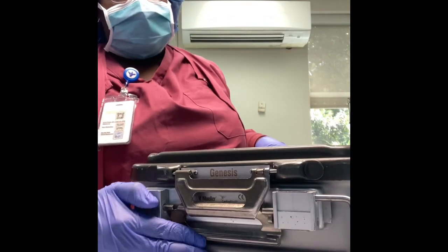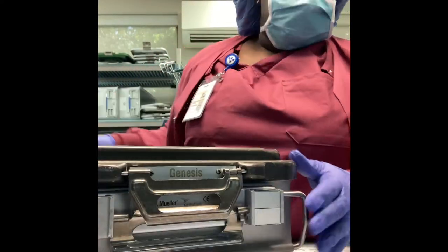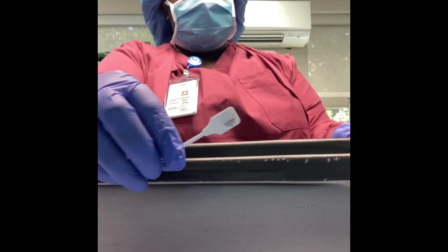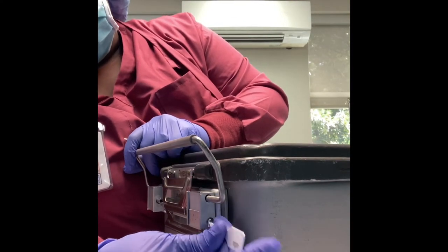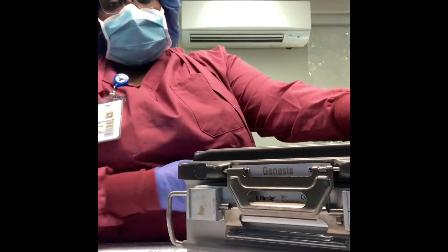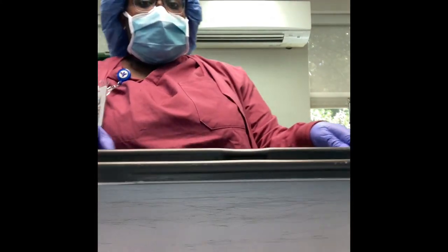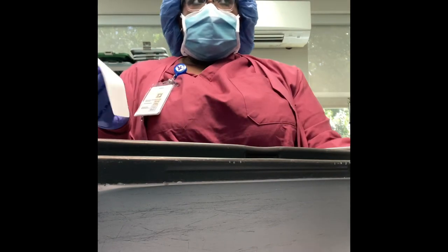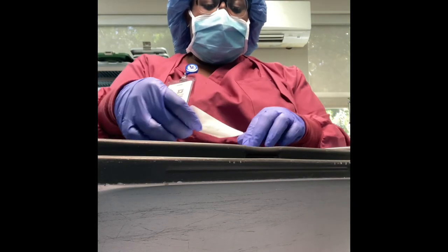The last step is going to be to put our locks — I'm just locking it up, going to the other side and locking that up as well. This is my favorite part. Then I'm taking my two white indicators — when this tray is processed, that lock will turn black on the side, basically saying that it was exposed to sterilization. I have my label here which says what tray it is, who did the tray, and what day the tray was assembled.